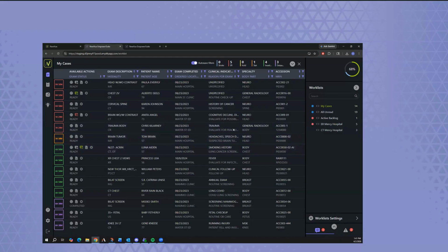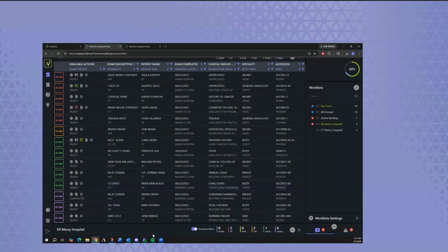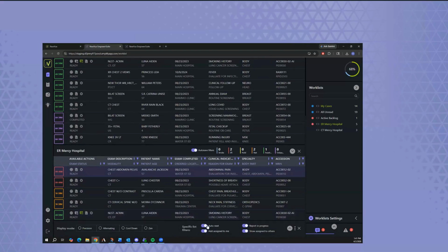You can, as Addison highlighted, you can navigate, you can kind of customize the UI how you want. So you can have multiple work lists open. You can use these for counts and monitoring. And you have simple settings here in terms of changing your preferences.